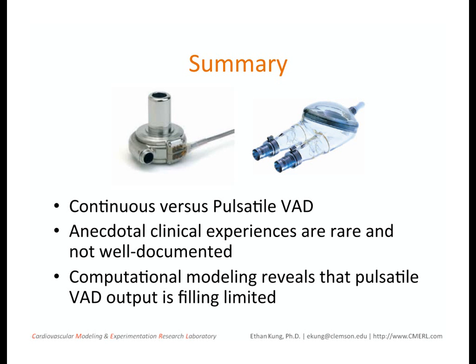In this study, we used computational modeling to reveal that in these patients, the flow output of pulsatile devices is limited by filling, when the device attempts to draw blood too fast from the ventricle and induces significant suction resistance.